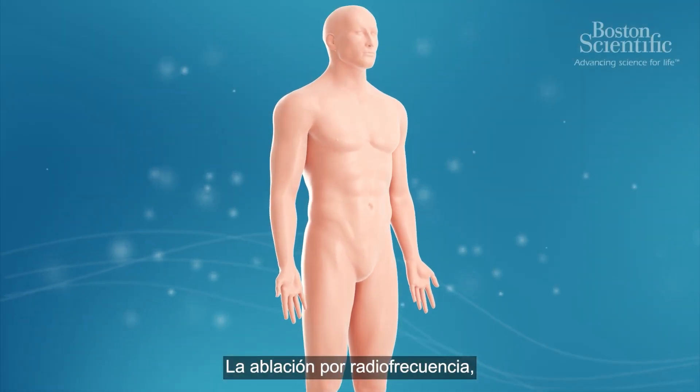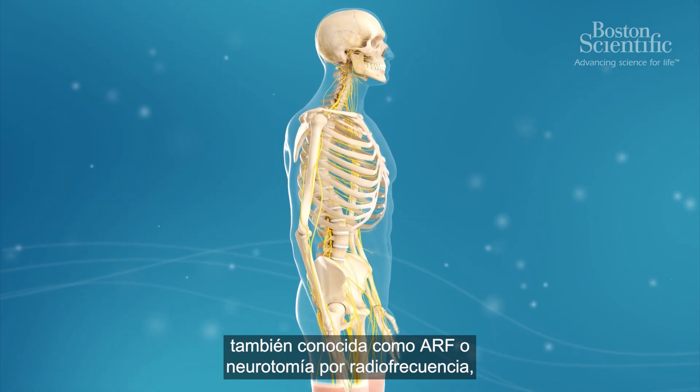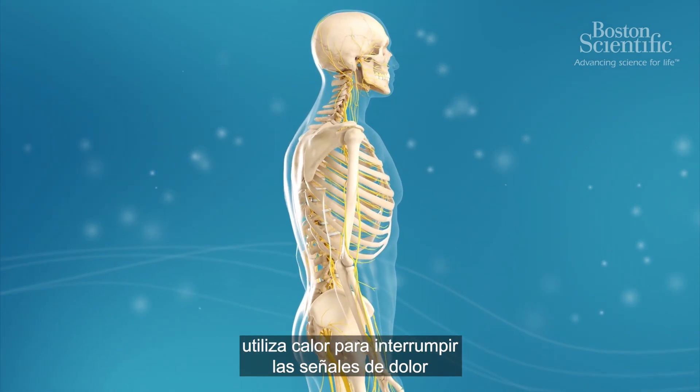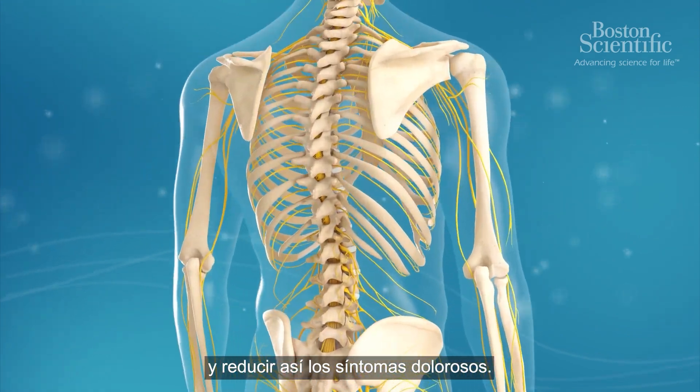A radiofrequency ablation, also referred to as RFA or radiofrequency neurotomy, is a procedure that uses heat to disrupt pain signals and therefore reduces the symptoms of pain.